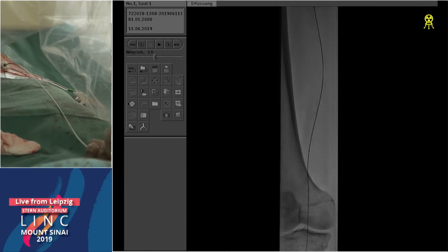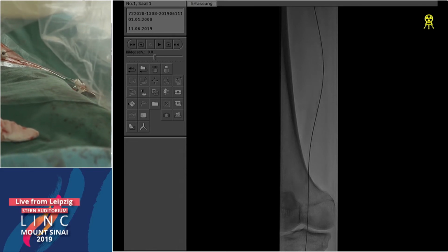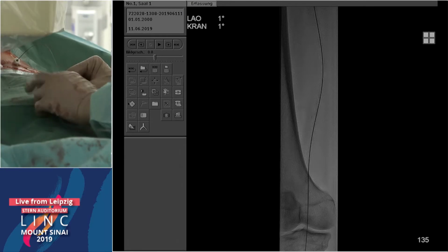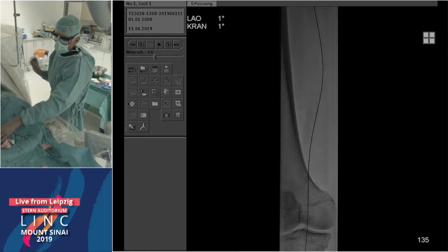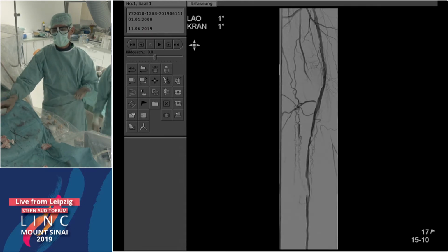I wonder how it would look if I had passed that plug more precisely, not with the Bollier technique, 1 centimeter to distal, as Giancarlo said. I don't think it would look very much different. It's just a small artery with a plug.